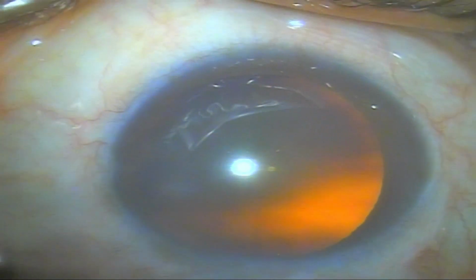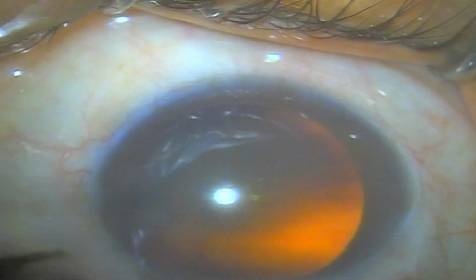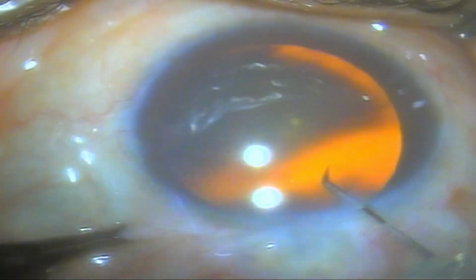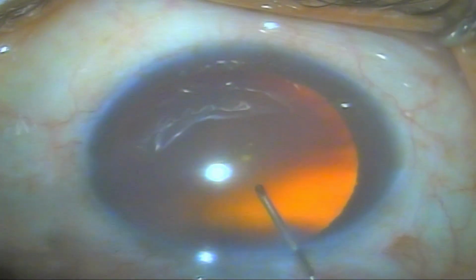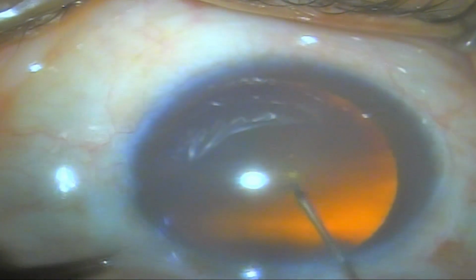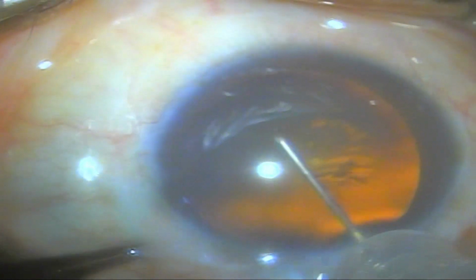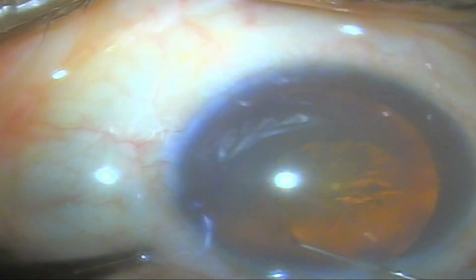In this video, I will show you the technique of closed chamber capsulorrhexis, which we usually perform with the help of a cystotome. In every case, the needle cystotome is passed into the anterior chamber through the surgical limbus, gray line. We have already discussed many times the advantages of using the surgical limbus. We do not make a full thickness corneal incision, and we do not take advantage of a full thickness corneal incision while doing the capsulorrhexis. This is all a closed chamber capsulorrhexis in an anti-clockwise direction, usually 5 to 5.5 millimeters in diameter.